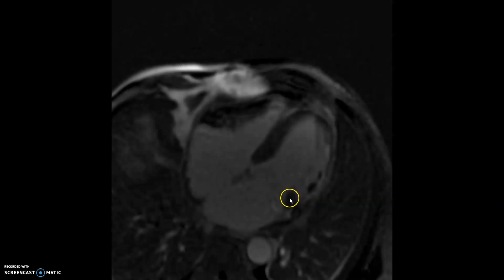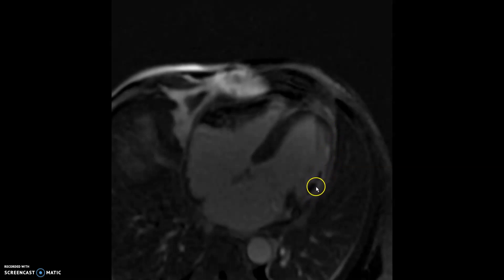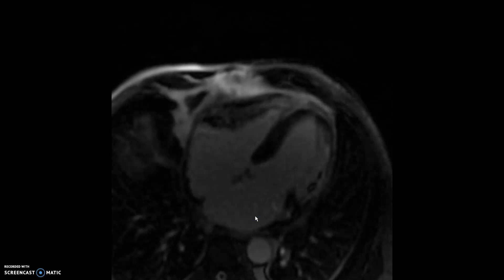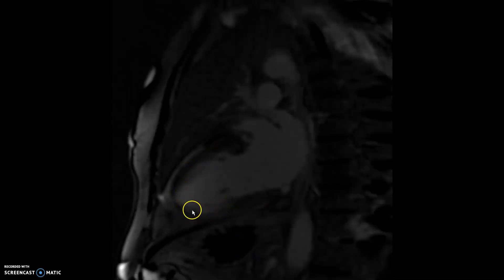The base is spared, and then from the mid wall to almost the apex, you can see delayed gadolinium enhancement with some hypo-enhancement in the middle, which is microvascular obstruction. The same thing is seen on the magnitude images and four-chamber view. On the two-chamber view, you can see subendocardial enhancement or almost transmural enhancement.